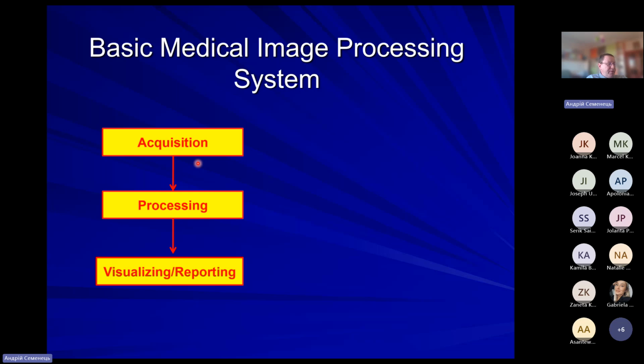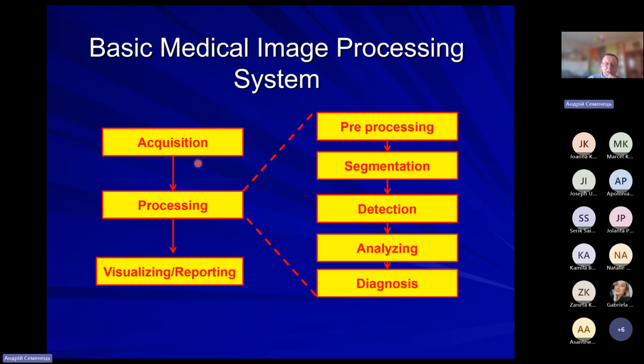Okay, now we will move to questions related to information technology and to image processing. So we will concentrate on this area, processing, which actually includes a few steps.